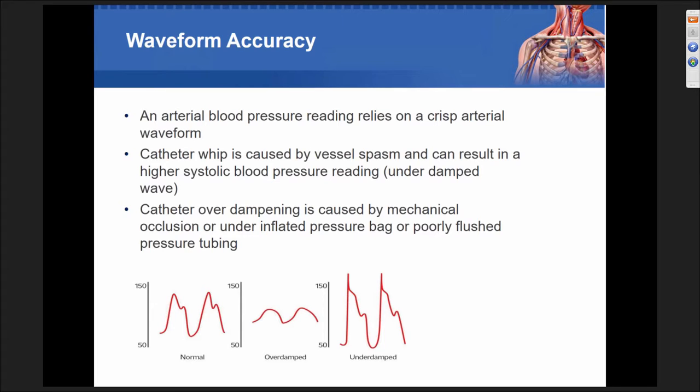needs to be accurate. A catheter whip, and you might be looking ahead at the slide a little bit, and catheter whip, people say, hey, how do I get rid of this catheter whip? Well, I'm going to tell you, you change your insertion technique, because catheter whip is caused when we don't numb the patient prior to catheter insertion, we place the catheter too low, we shock the vessel by putting the catheter in by not preparing it, letting it know we're coming by that numbing medication and preparing the patient if they're anxious. And whip is caused by vessel spasm, and it goes away over time.